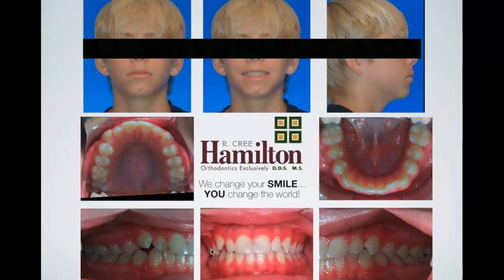So we want to, hopefully, use some sort of mechanics that can bring those teeth down more. Currently, when we treat cases like this, one of the things that we'll offer them is TAD extrusion of the anterior teeth. We always start out by using wires to get the teeth down as far as we can, like reverse curve of Spee wires on the top and on the bottom, and bring those incisors down as far as we can with the wires alone. And then we look and we reevaluate.